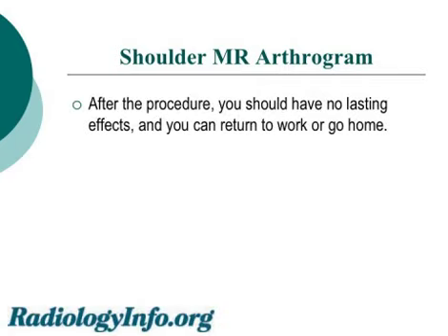After the procedure, you should have no lasting effects, and you can return to work or go home, but you should avoid strenuous exercise for about 24 hours.